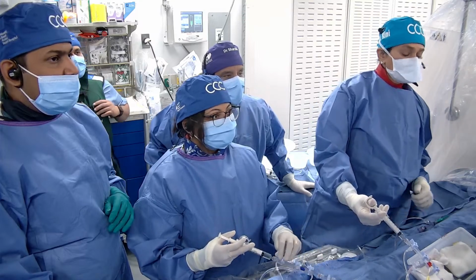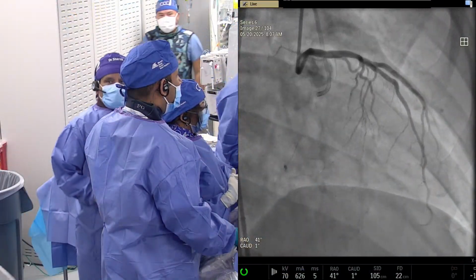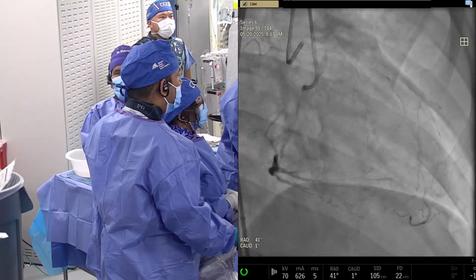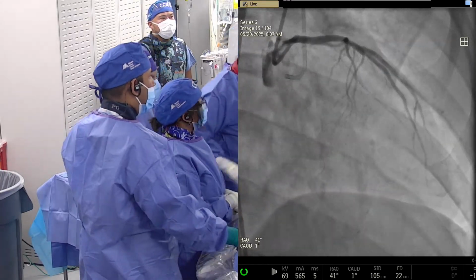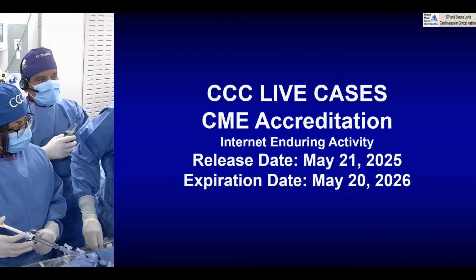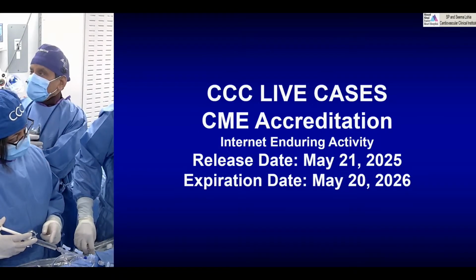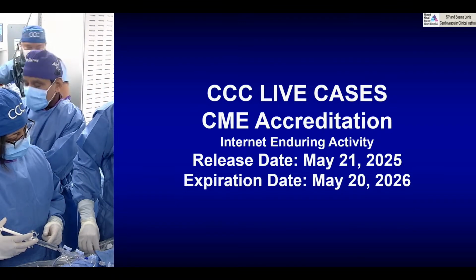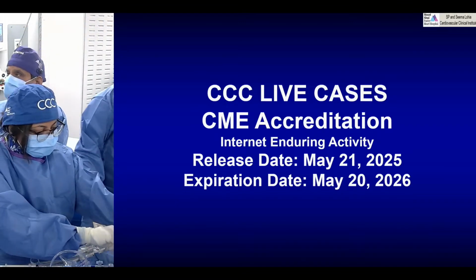Wow. Okay, so if we can go through our presentation. So let's go, because Dr. Kini is ready here. You go to LAO view. In LAO, we have a lot of collaterals, bridge collateral. That's what they tried. So this is the case. Remember, this angiogram is done almost 6-7 months later than the first time. So this is our live case.